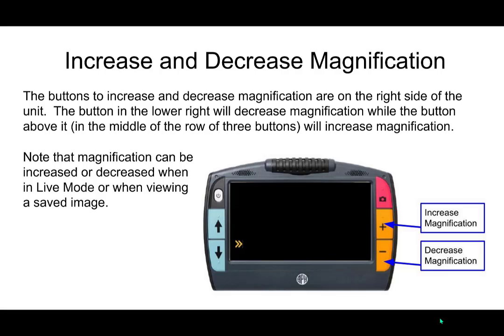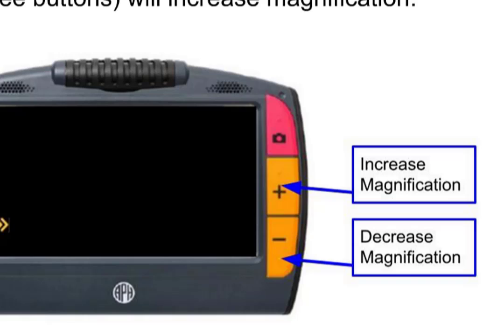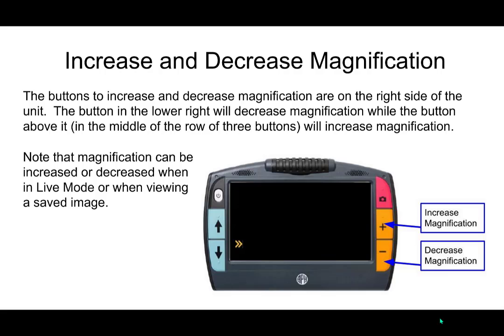To increase and decrease the magnification, we talked about where those buttons are located, but let's review. They are in the lower part of the right-hand side of the unit, and they are orange or maybe yellow in color. I'm not really quite sure, but they're sort of in that range. So you can hold these buttons down to change the magnification. The top button, directly underneath the capture button, is the magnification up, or increased magnification, and decreased is at the very bottom right. You can activate these buttons when in live mode or once an image has been captured. So if an image has been captured and you want to zoom in on a spot, you can use these buttons in that captured image or captured text as well.